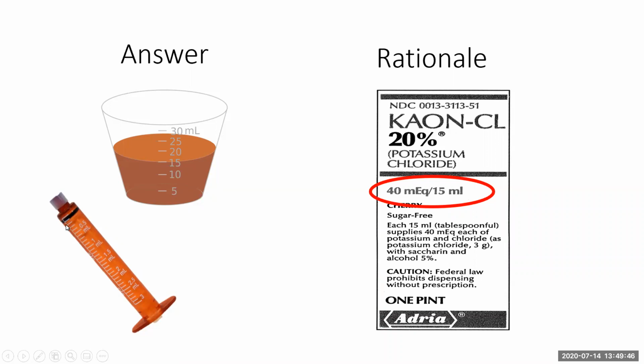I've shown you here an oral syringe. Most oral syringes only go up to 3 mLs because you don't really want to squirt more than that into somebody's mouth. Some might have 5 mLs. None will have 15 mLs. Someone can swallow this easily, but to squirt it in is going to be a lot of volume. So you can't pick a syringe for this dose of medication, even though the title of the quiz was syringe selection. You will have to use a dosing cup for this. One thing you can do, if this is a bottle, is draw it up with a syringe and measure 15 mLs and put it into a cup, or draw up 7.5 mLs and then put it into a cup so that the patient can then swallow.